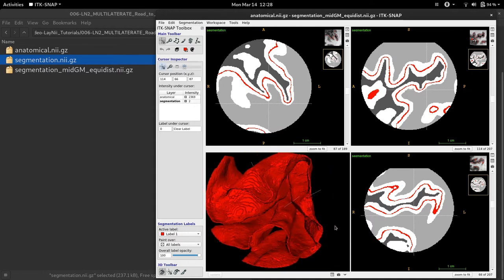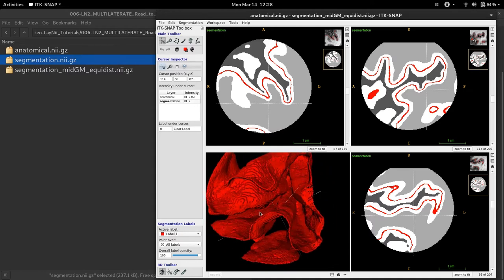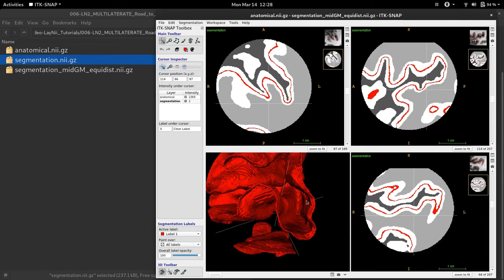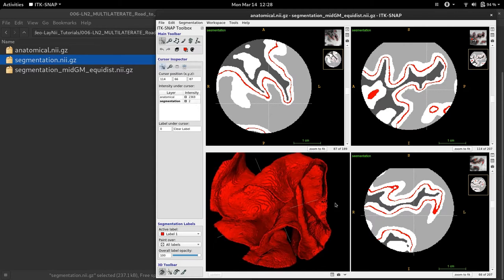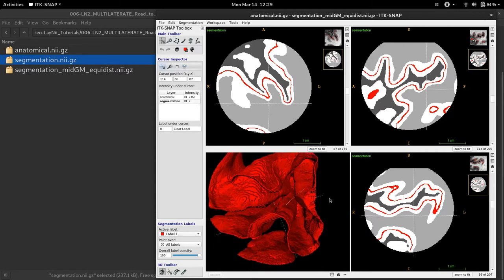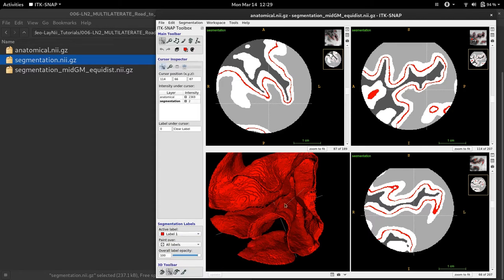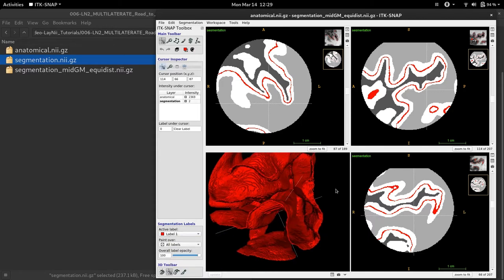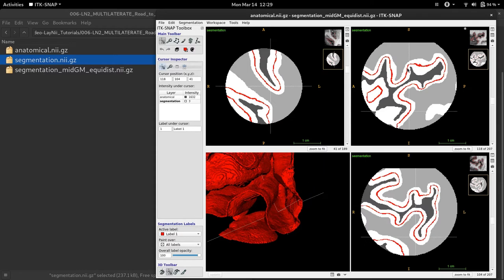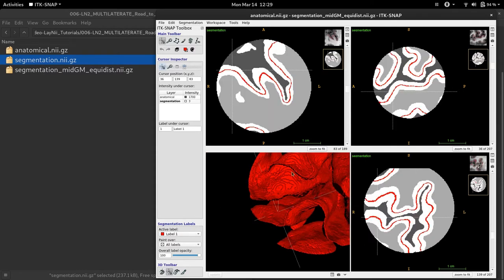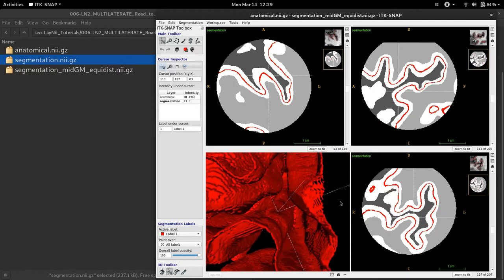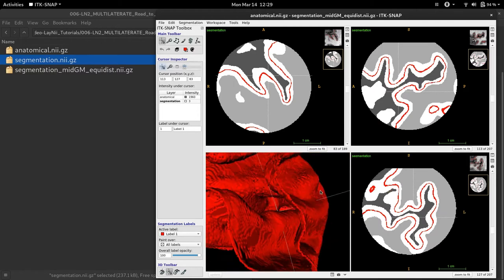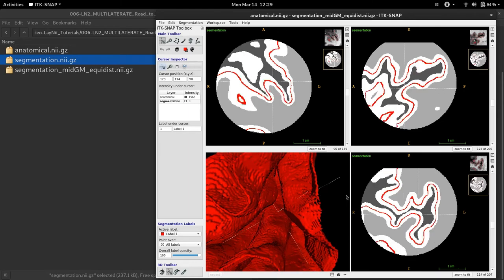And here, I am interested in this anatomical landmark which is the Heschel's gyrus. As you can see from this angle, this gyrus. As an input to my Ln2 multilaterate algorithm, first I need to select a center point. To do it, I use quickly ITK snap. I use the 3D toolbar second option which is a 3D crosshair mode. And in this mode, if you click on your cortical mesh, it will bring you to that point in the volume. For instance, here I am clicking around. So, I would like to center my disk around the center of the Heschel's gyrus, let's say around this region.